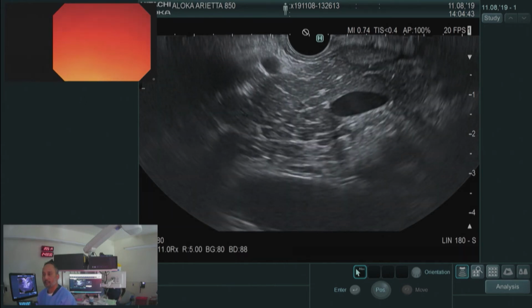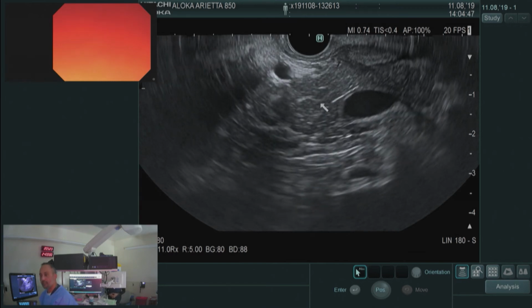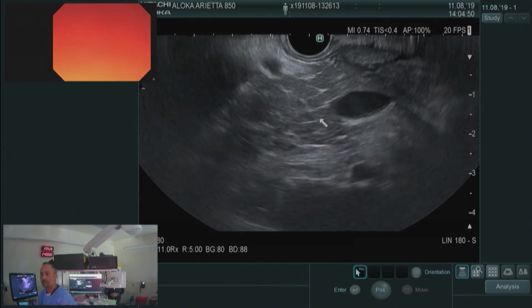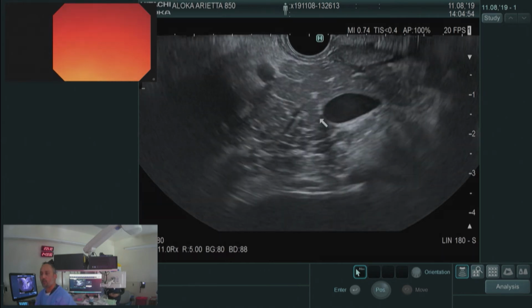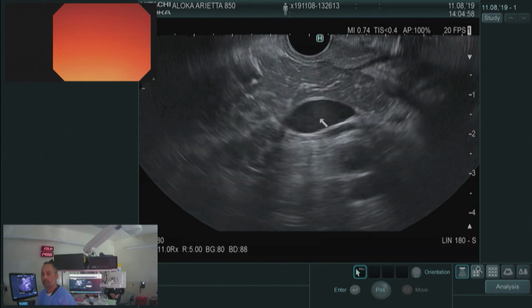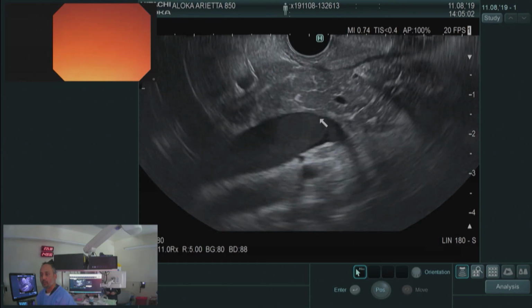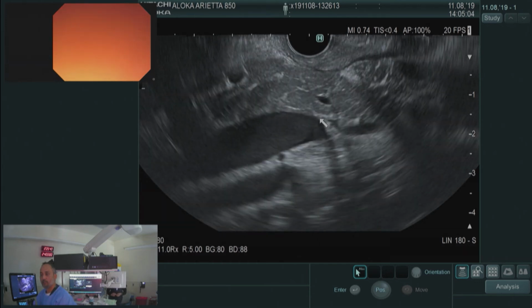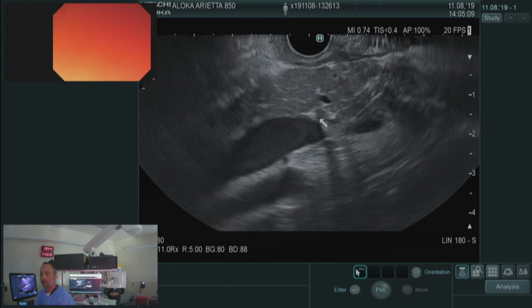You can kind of catch a glimpse of the pancreatic duct there in the neck. Again, not very dilated, very diminutive duct coming through here, right through there. And then as we come back more, I'm pulling back gently on the scope and also continuing my torque, and we can kind of just see how that duct sort of rides over that portal confluence. And then we kind of head back towards the body here. Again, the duct's a little irregular, but otherwise non-dilated.